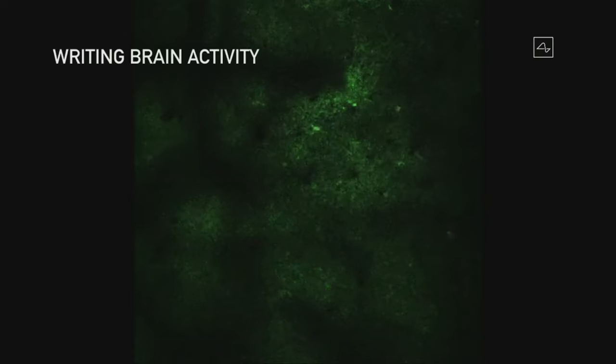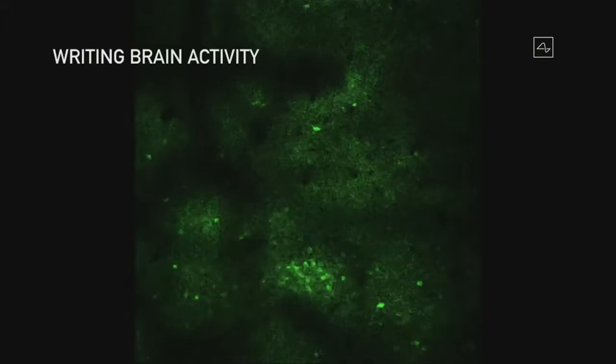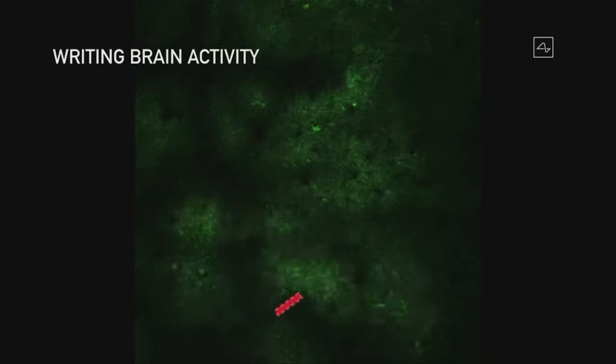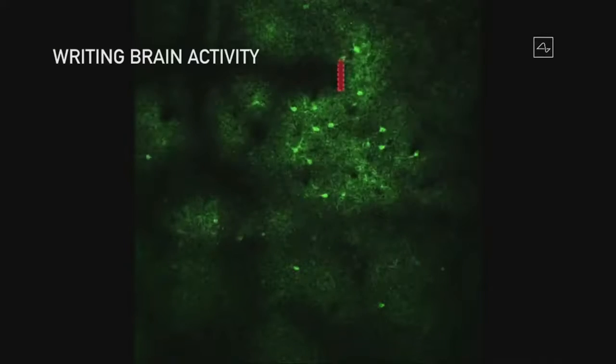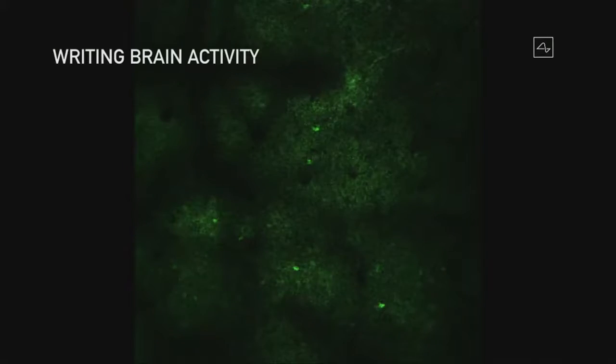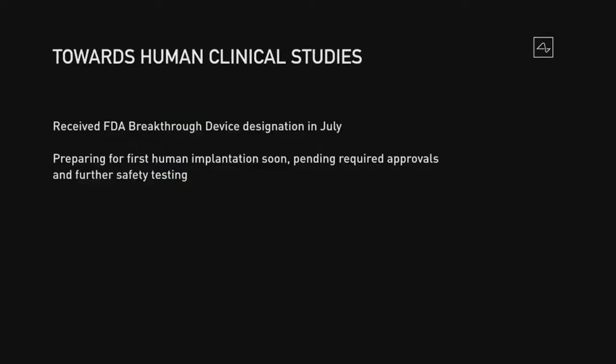It's very impressive technology. You can actually literally see in real time how the neurons are firing. So the red flashing things are the electrodes firing, and then the green are the neuron bodies responding to the current from the electrode. And we're making good progress towards clinical studies. I'm excited to announce that we received a breakthrough device designation from the FDA in July, thanks to the hard work of the Neuralink team.